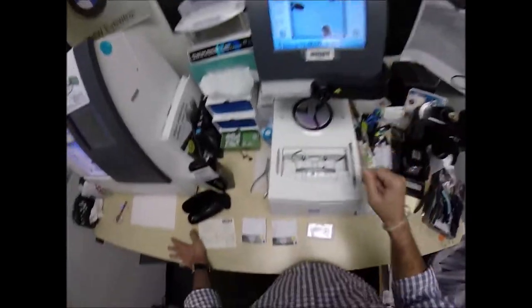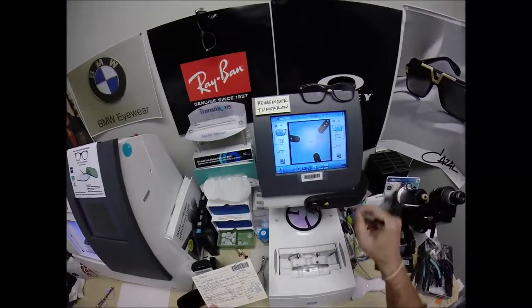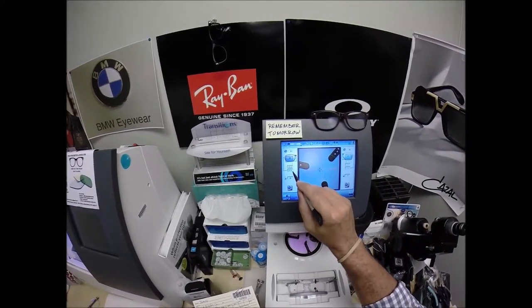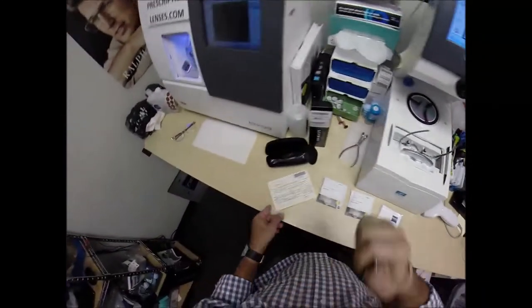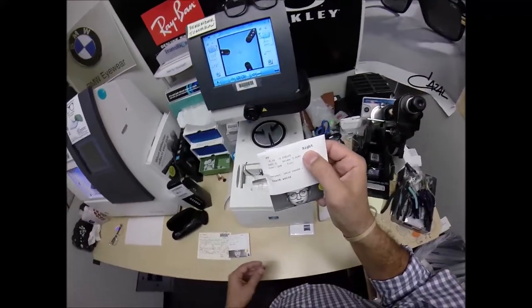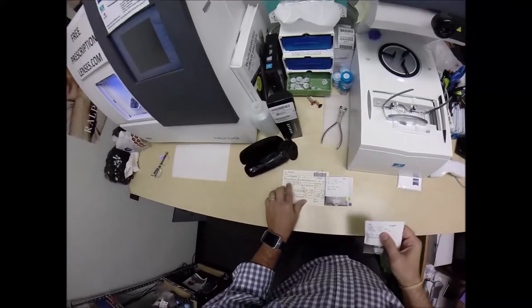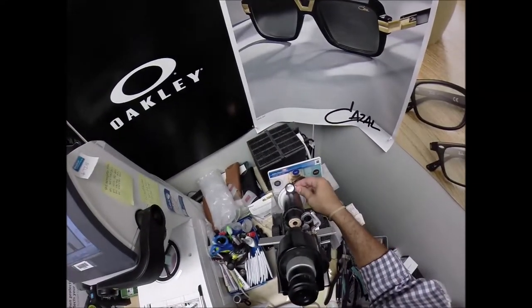Now, that is the shape that I'll be cutting. I need to enter your pupillary distance, which is 31 for the right eye. The computer starts at 32.5, so I'm going to tap this minus button until we get to 31. I want to raise the optical center height up to, we're going to go 2 above and do it at 24. So, your right lens, I assume this is it because it says right. Isn't that right? So, your right eye is minus 6.50 at 125. Put the axis wheel on 125.